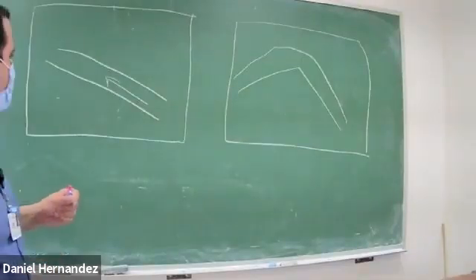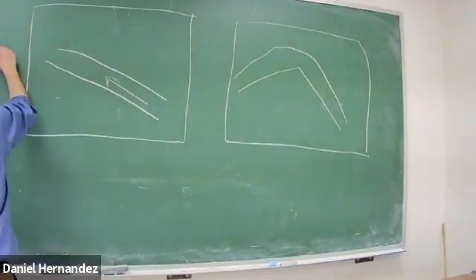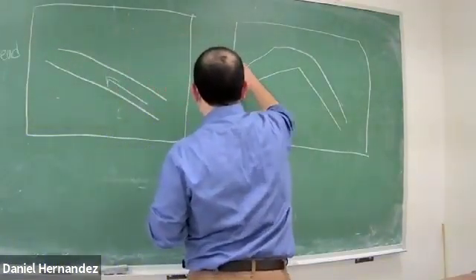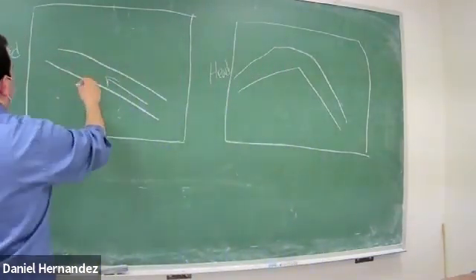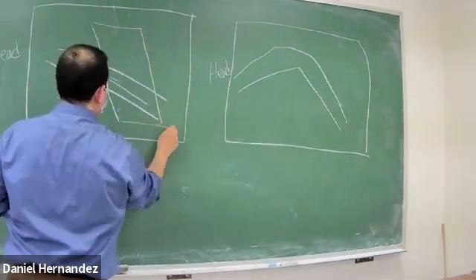That's pretty good. So we'll just pretend like we're doing carotid arteries, and we're assuming the blood flow is going in this direction towards the head. So this is a long view. I have a color box, and I'm steering in this direction.